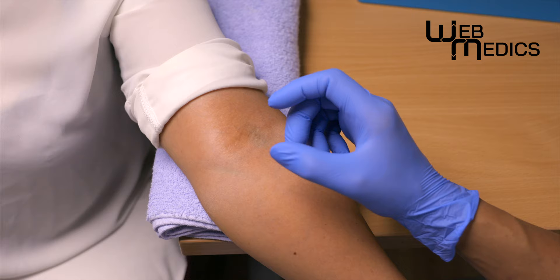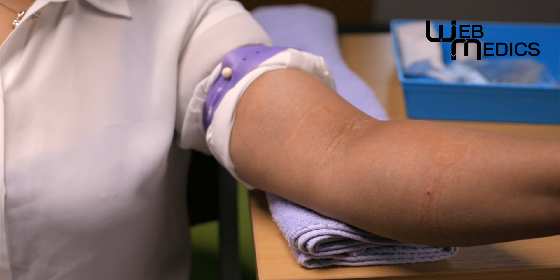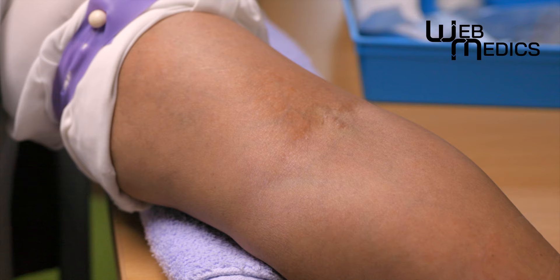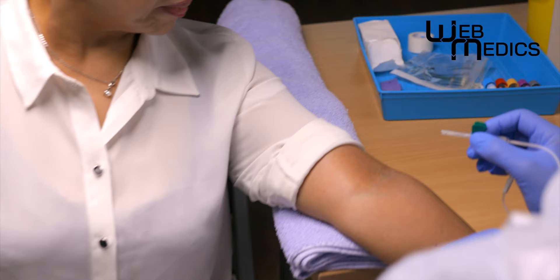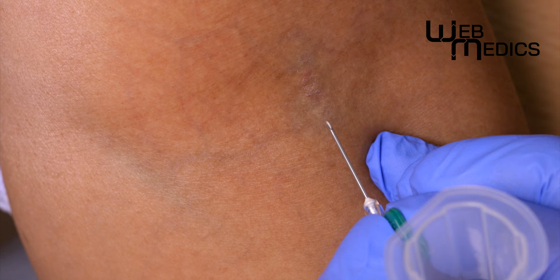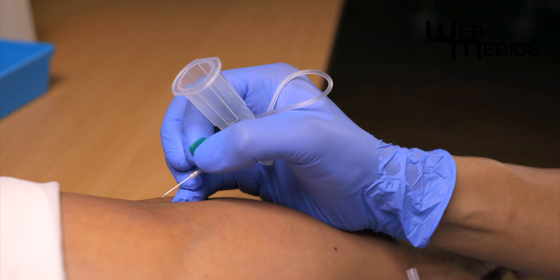There are three primary aspects to each component of position, angle, and maneuver. Position of the patient to ensure that they are comfortable and supported in case they flinch due to pain, and to highlight their veins, both visually and on palpation. Position of your body to ensure our natural needle line is matched with the direction of their vein. Position of our hand with the needle to help set the needle angle correctly.